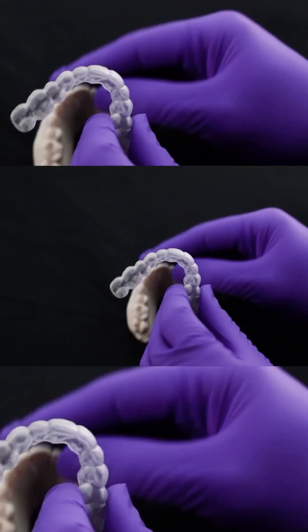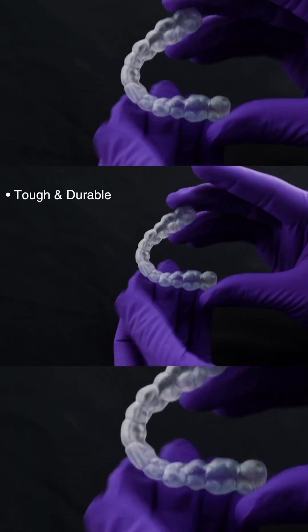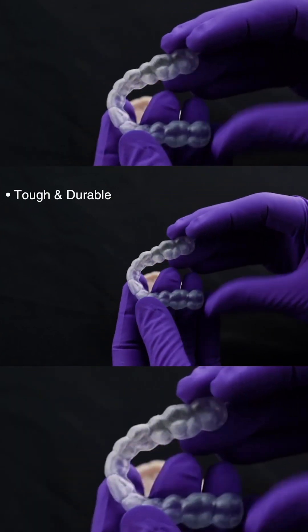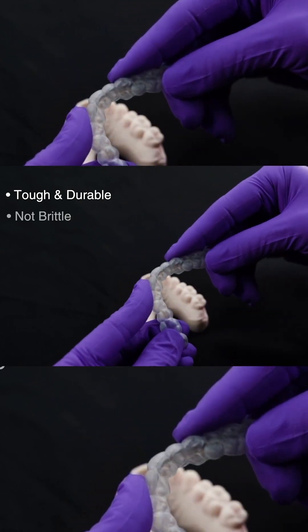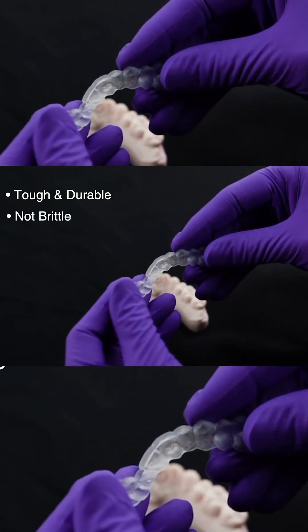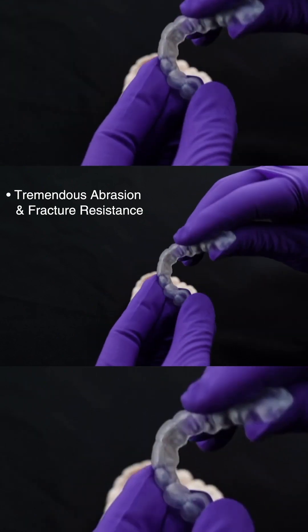Like a hard splint, KeySplintSoft is tough and durable and able to withstand the forces of bruxism. Unlike a hard splint, KeySplintSoft is not brittle and remains flexible for patient comfort with tremendous abrasion and fracture resistance.